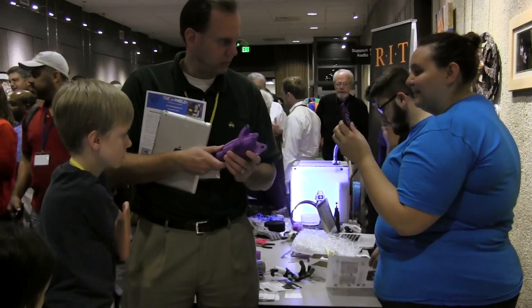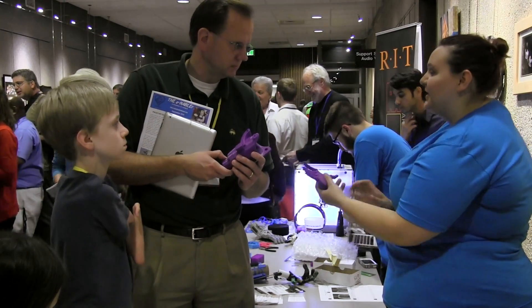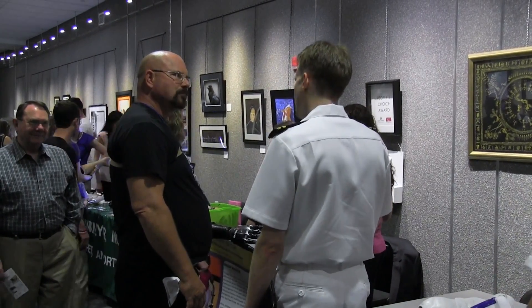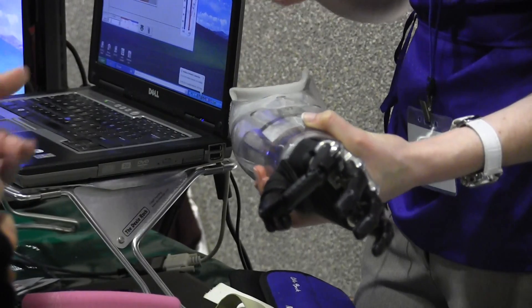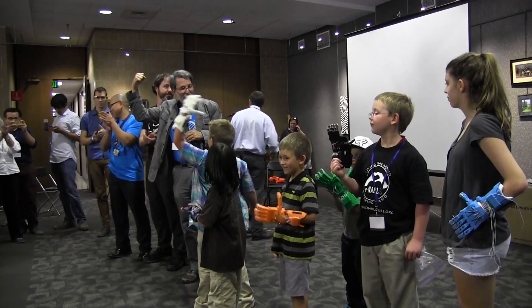I really think with the open source software that is available for these 3D prints and the brilliant minds and individuals involved, we are seeing an exponential growth in the complexity of designs. There will be a crossroads between traditional prosthetics and 3D printed prosthetics — a point where we won't be able to tell the difference between the two. One last round of applause for the Cyber Superheroes.